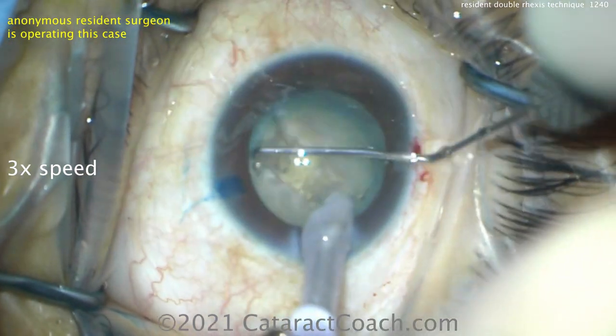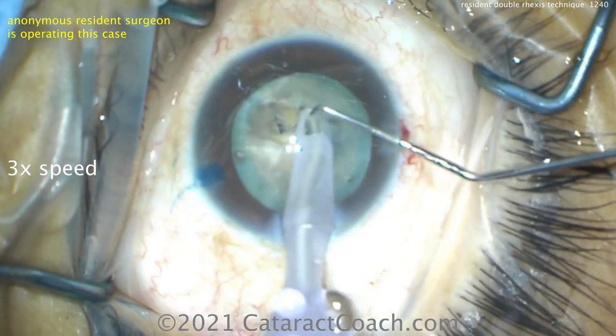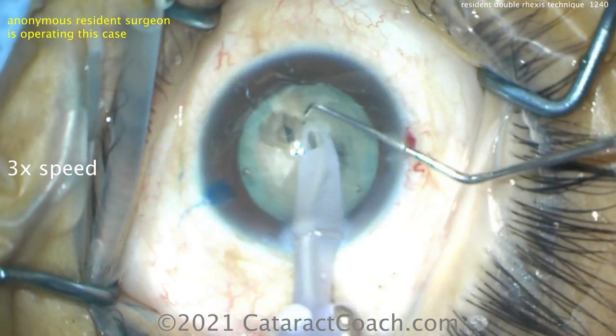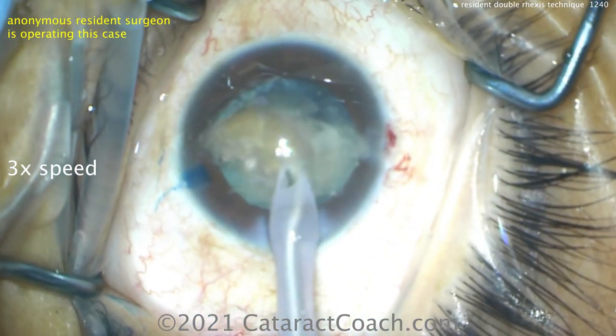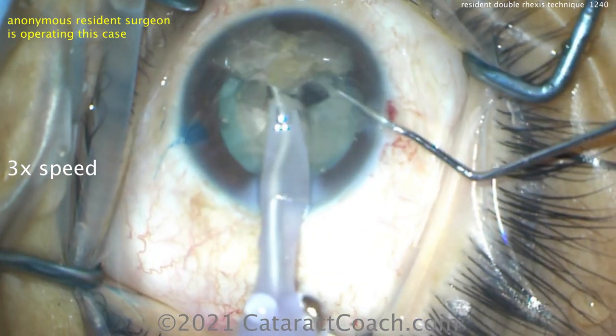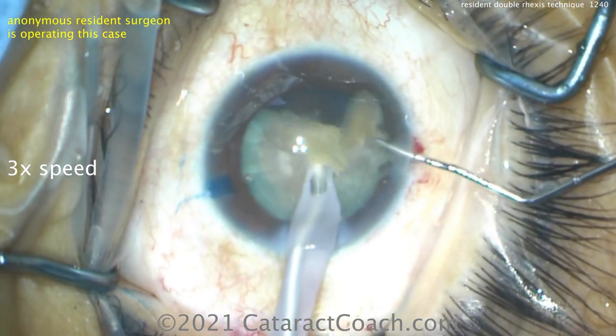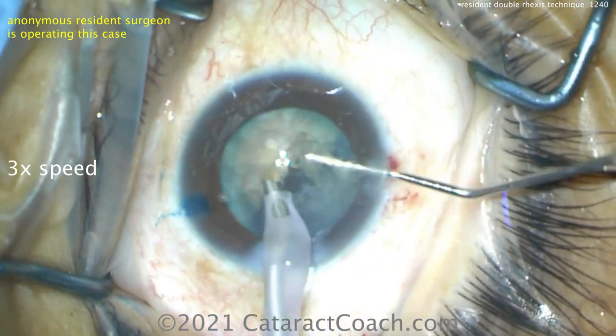And now here's the first half of the nucleus being brought up, and it's going to be chopped — stop and chop technique. A little bit of help there to bring that piece up. The chopper is going to help break this into smaller pieces, and that can just be emulsified pretty easily. And then the other half, of course, is much easier to chop because there's a lot more working room.